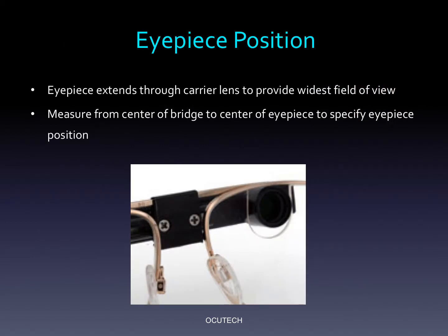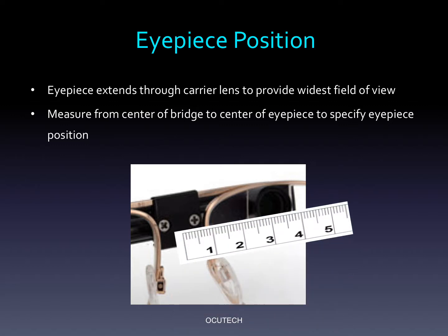The VES Sport eyepiece extends through the carrier lens in order to offer the widest field of view possible. When you order the system, the carrier lens will be slotted to allow the eyepiece to pass through. The slot is made slightly oversized to allow for fine tuning at the dispensing visit. Once you have determined the ideal position of the eyepiece, use a millimeter rule to measure from the center of the bridge to the center of the eyepiece to determine the proper eyepiece position.